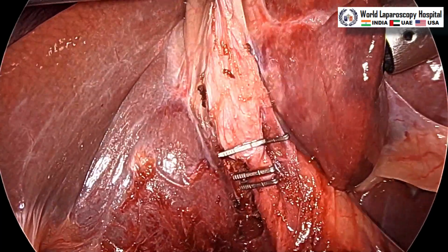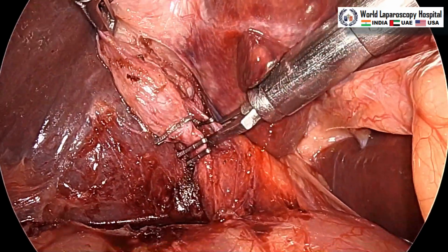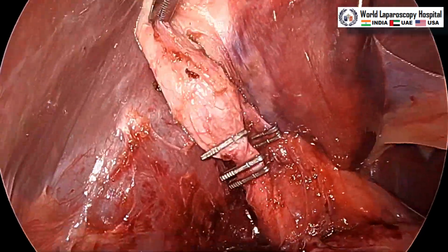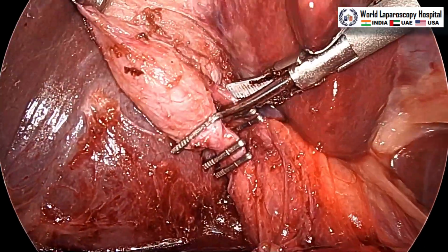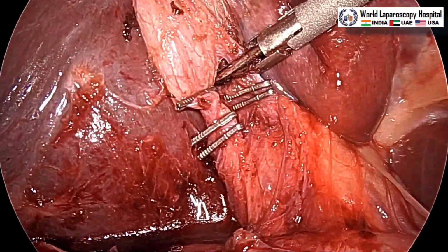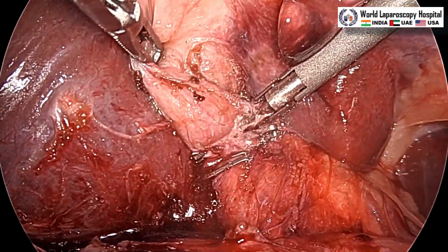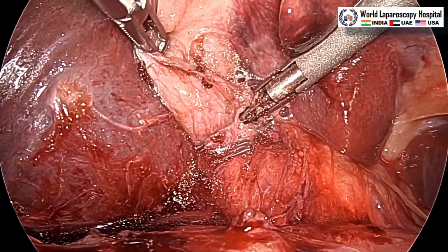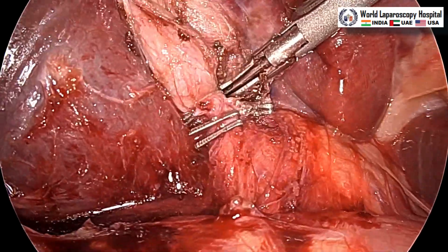Here we will use harmonic to cut the cystic duct and cystic artery. This is the second clip over the artery, and now this harmonic will cut the artery first. You should keep it relaxed when you are cutting the artery, so that a minimum of the harmonic will do the proper sealing. At that time a lot of traction should be avoided.